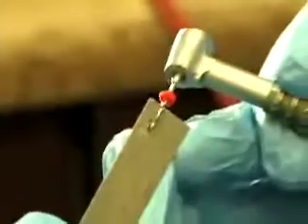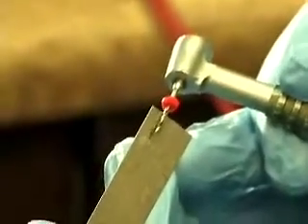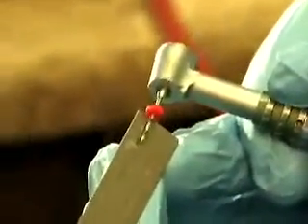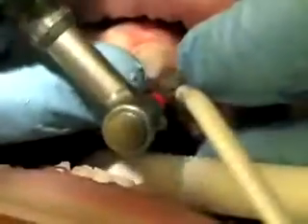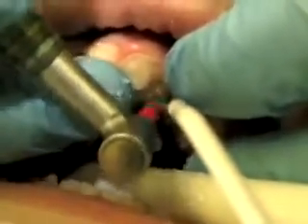Today we're using a 15-millimeter implant and we only want to drill in about one third of the way, or about five millimeters into the bone. We also need to allow an extra six millimeters for the depth of the guiding sleeve, so the stop is set at about 11 millimeters. Make sure the stent is on tight, insert the pilot guide, then begin drilling. Let the sleeve guide your drill and gently pump in and out while flushing the area with water.